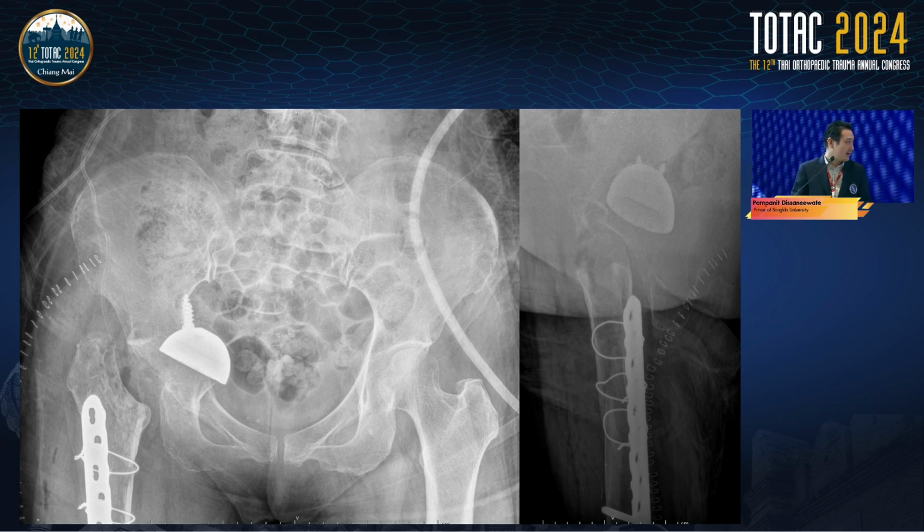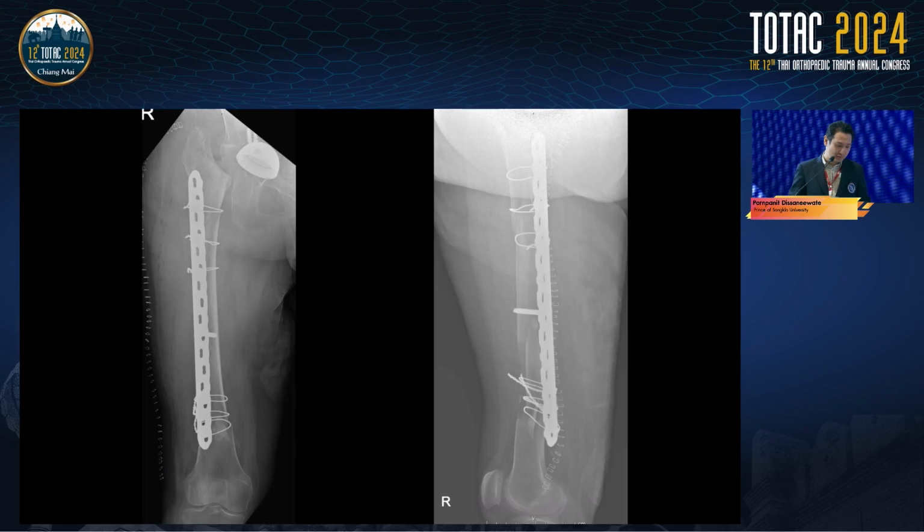As far as I know, when the doctor tried to do the total hip arthroplasty and broached the femoral canal, the femur broke the first time. Then he tried to use a longer stem and it also broke. So this is the shape of the femur.